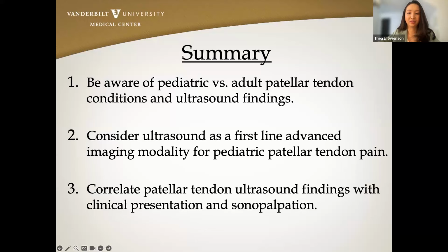Patients with Sinding-Larsen-Johansson syndrome may have osteochondral changes in the anterior knee long-term, but may not actually have symptoms as adults. So we wouldn't want to make a big deal out of the cortical changes at the patellar tendon if this patient did not actually have pain. And in fact, some of these findings or changes may actually be adaptive to their sport. But based on our ultrasound exam and the fact that he was symptomatic, we did diagnose him with this condition.